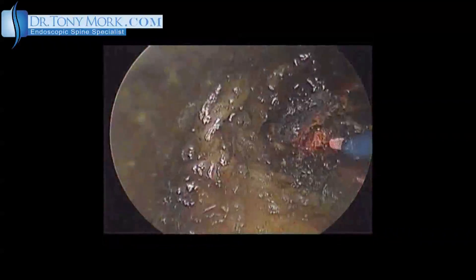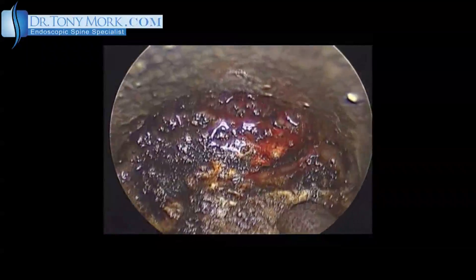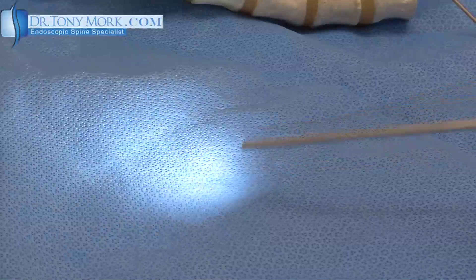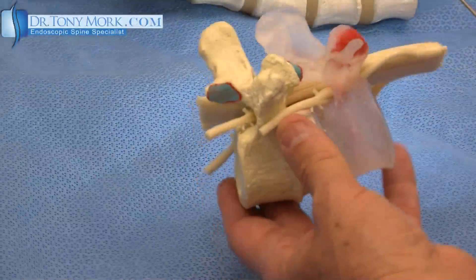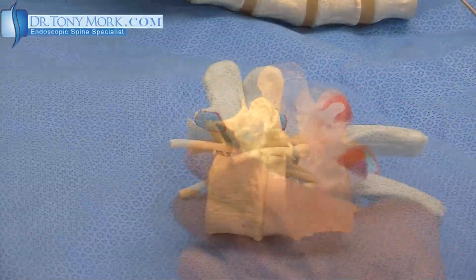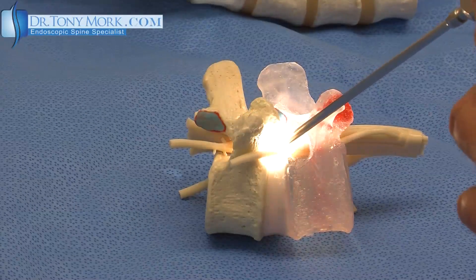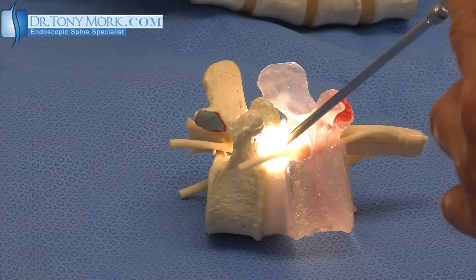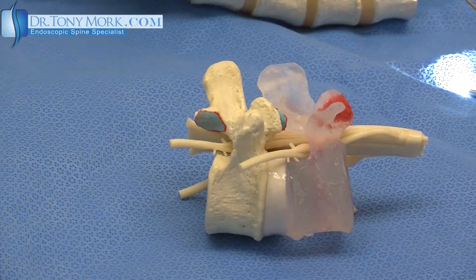It makes the size of the incision necessary to get this in there very small. Look at the size of the incision you'd have to make to put something like this in place. You don't need very much space in order to get this light source in there, and you can get directly at the problem without violating much soft tissue around it.